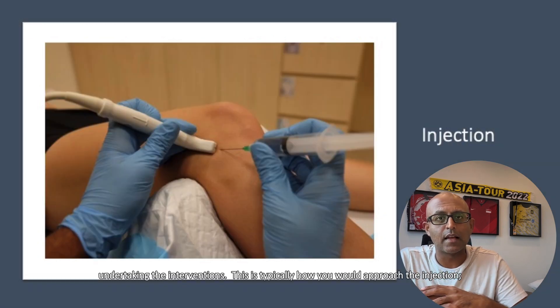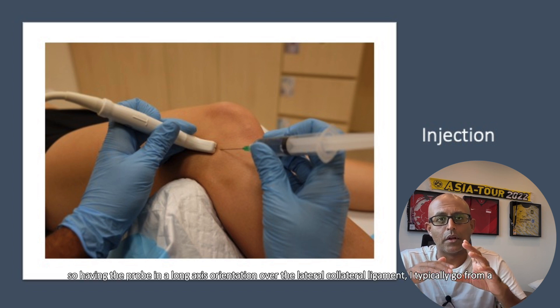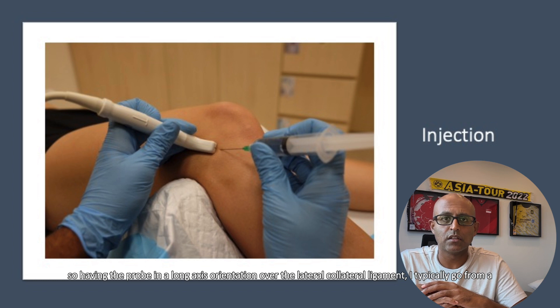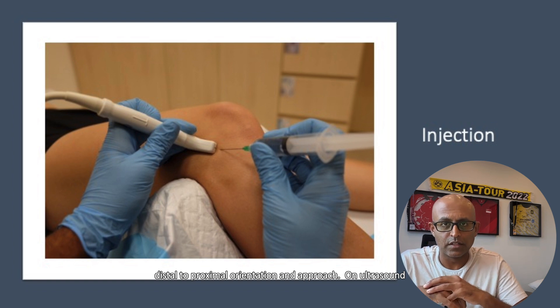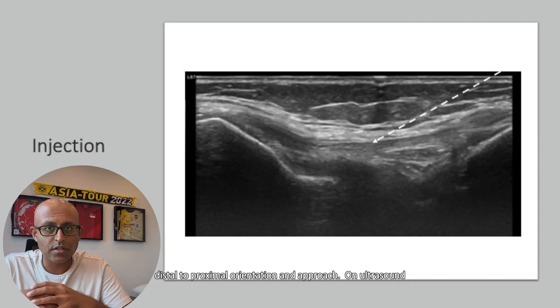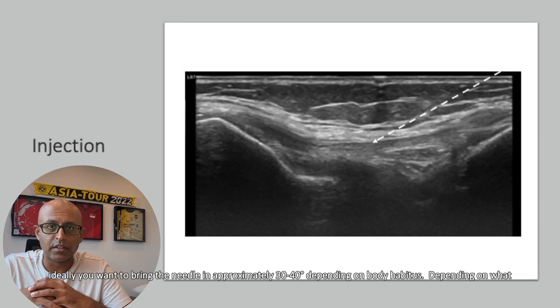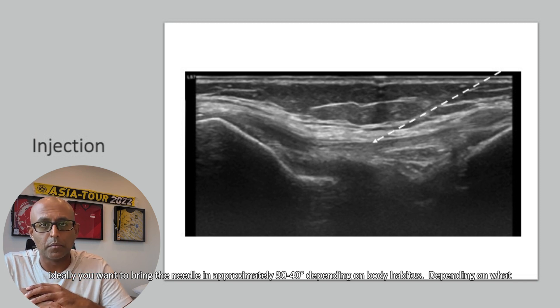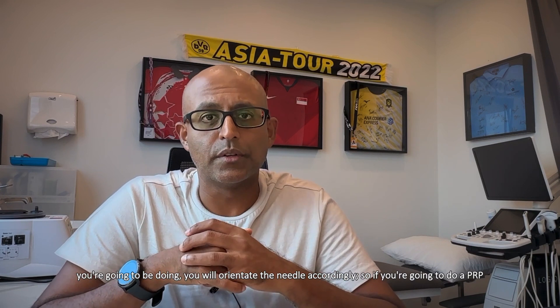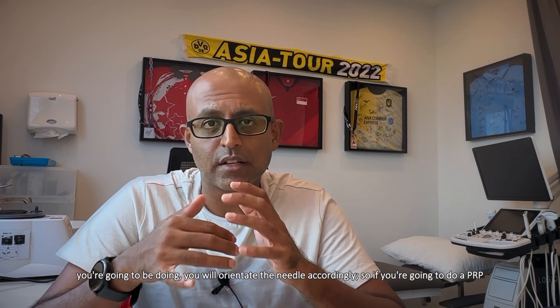This is typically how you would approach the injection. Having the probe in a long axis orientation over the lateral collateral ligament, I typically go from a distal to proximal orientation and approach. On ultrasound, ideally you want to bring the needle in at approximately 30 to 40 degrees, depending on body habitus and what you're going to be doing — you will orientate the needle accordingly.